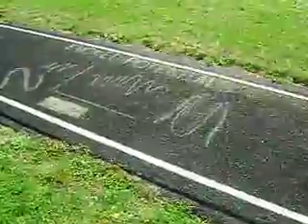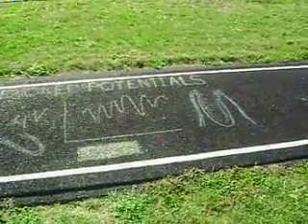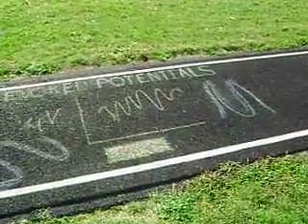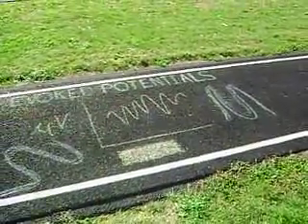The actual signal recorded may either be near field, where the electrode is placed near the generator of the signal in the cortex, for example, P100 wave of the VEP generated by the occipital cortex, or far field, where the electrode is placed far from the generator of the signal, which is volume conducted through the tissues of the body to the recording electrodes on the scalp. For example, P11 wave of the SEP generated by the dorsal root entry zone.